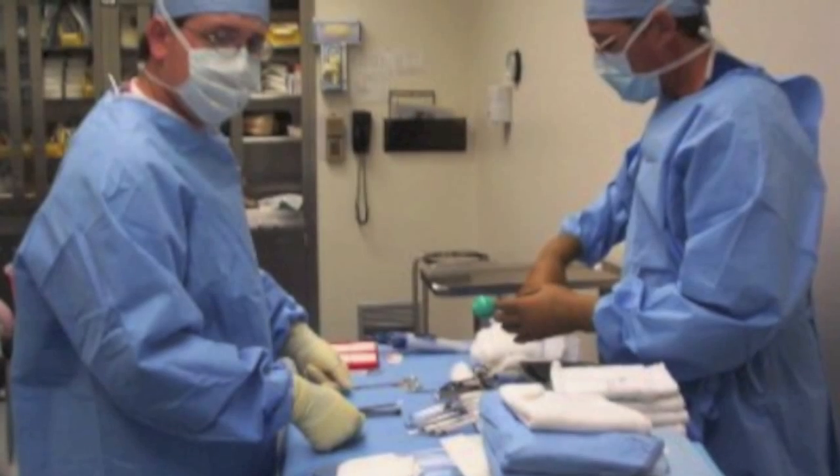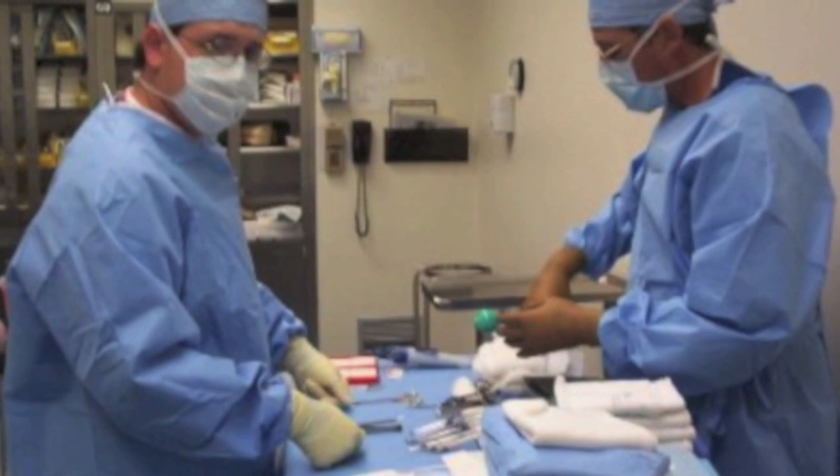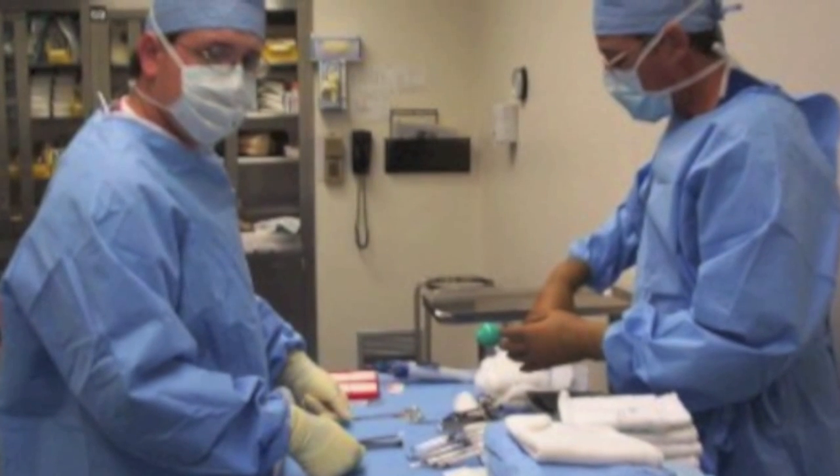Make sure the patient has some analgesia — maybe some Dilaudid, some morphine, maybe some Ativan to kind of relax them — and go ahead and start the procedure. It is a fully sterile procedure. This is the one place where you want to do a surgical scrub of your hands. You want to set up in a sterile gown, get sterile gloves, get a mask on, get a hat — the full work. You want full barrier precautions, which means put the full sterile sheath over the patient so that everything is covered. You're going to use antiseptic solution, either iodine or alcohol wipe, whatever your hospital uses to clean the area well. Let that dry, and then go ahead and start the procedure.